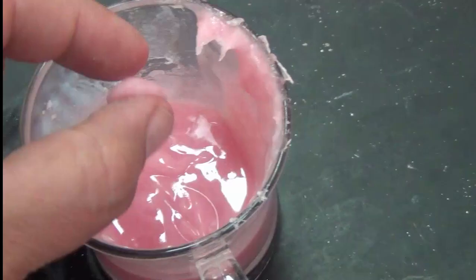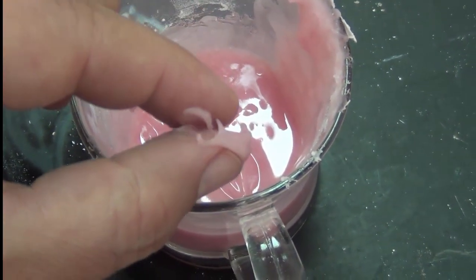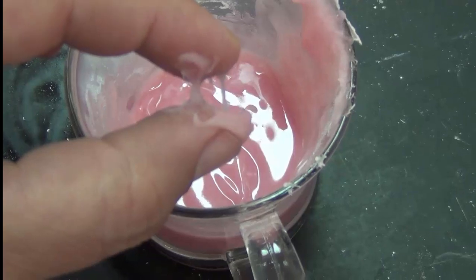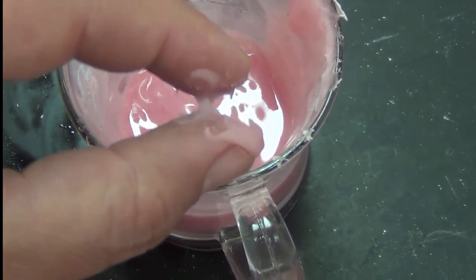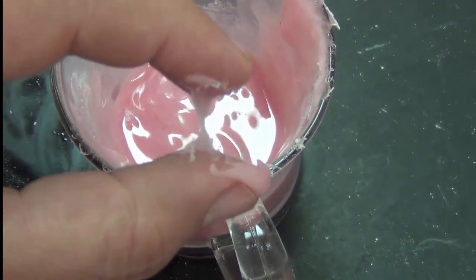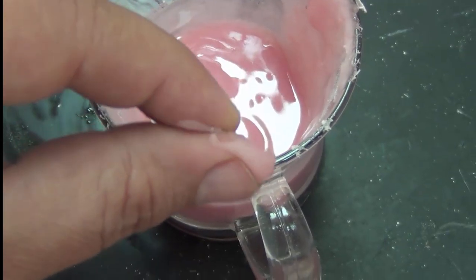It's still in the stringy stage, but I want to demonstrate for you how the stringy stage appears. If I separate the material with my fingers, it occurs in strings. This is because the acrylic monomer had penetrated into the powder, but it did not penetrate into the bulk of the powder. It's only on the surface. So this is why it's sticky, meaning that powder to powder, it's sticky with each other, while inside the powder it's still not dissolved. So this occurs, the stringy stage or sticky stage.